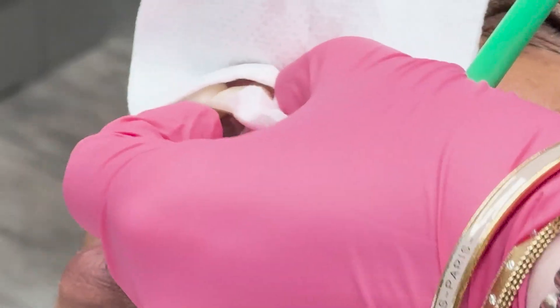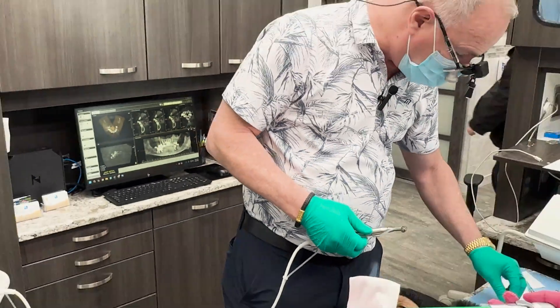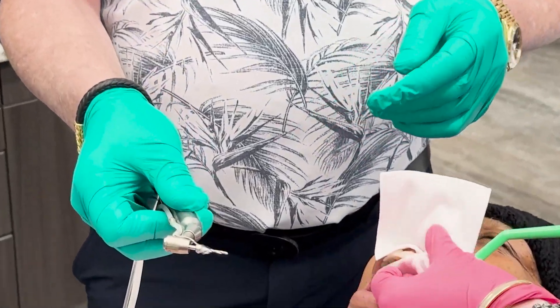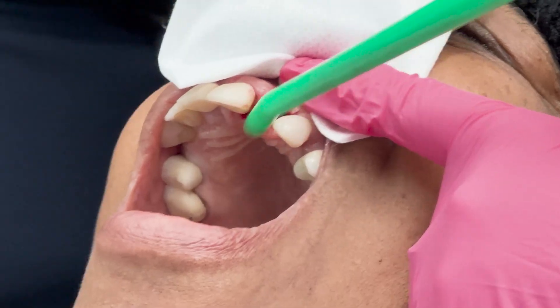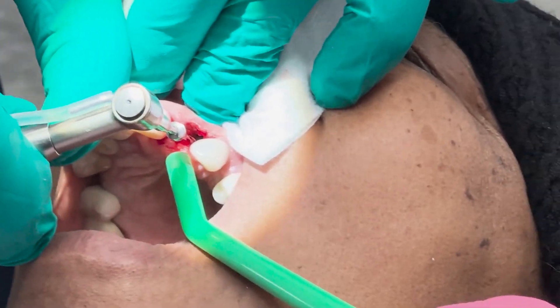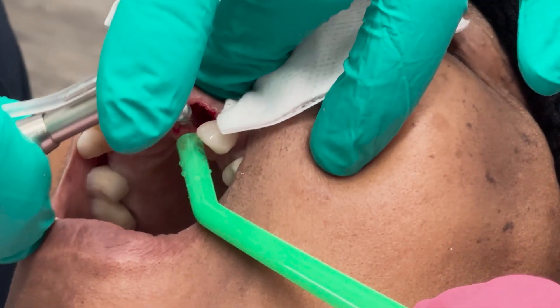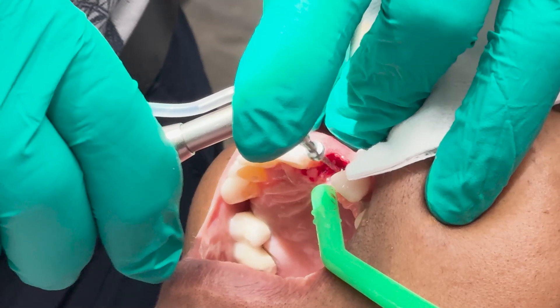Now we're going to go ahead and place our pilot hole for the 3-0 mono implant. We're going to use a 1.5 millimeter pilot drill. We're going to go ahead and make a pilot hole, and because it's far down there we're going to use a drill extender. When we do this I want to go about two or three millimeters from the crest of the ridge at a slight lingual angle.